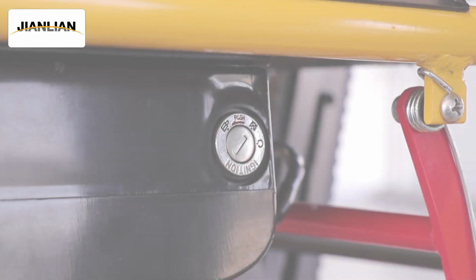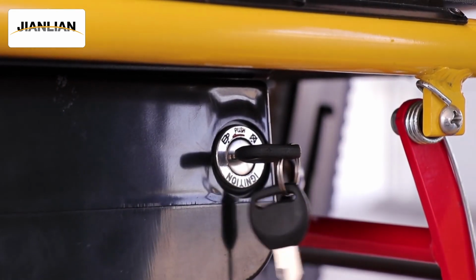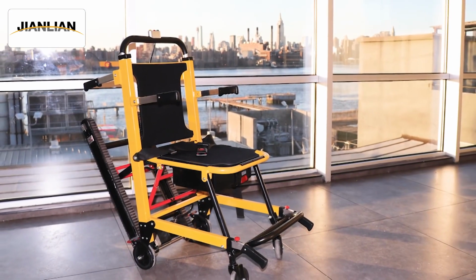Once the battery is fully charged, insert the key on the side of the battery and turn it clockwise to the red circular symbol to power on the battery. The red indicator light will illuminate when the battery is powered on. The stairlift is now ready to use.